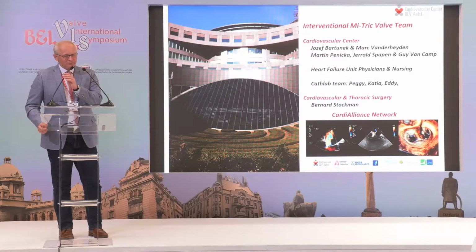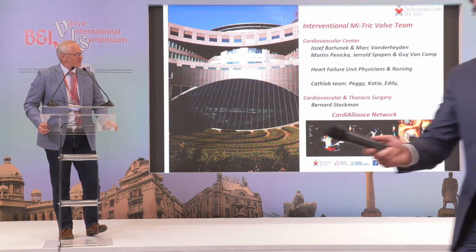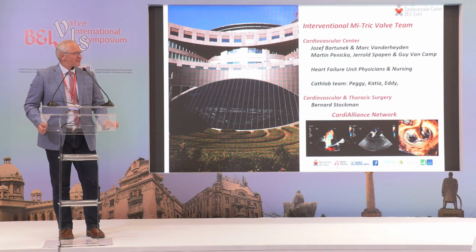I agree with what you said about the disproportionate, because also the quantification of MR with the methods that we are using is difficult. In local discussions, when you are really prudent and apply all the criteria, you end up with numbers that are not realistic, simply because of the bias that you are introducing by using PISA and all the similar factors. So it's not always easy.